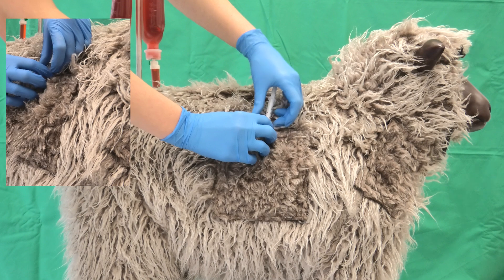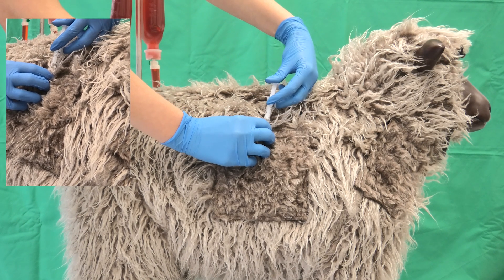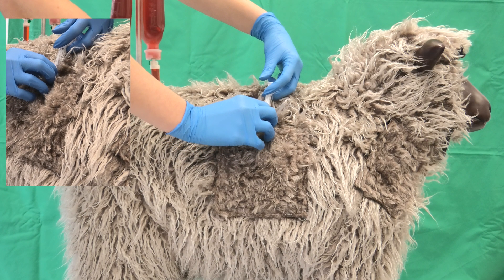The cannula hub is fixated and the syringe is aspirated through a gentle pull of the plunger. If no blood flows into the cannula hub, then the solution can be injected. Otherwise, the cannula tip is left in the animal and a new injection area is chosen.